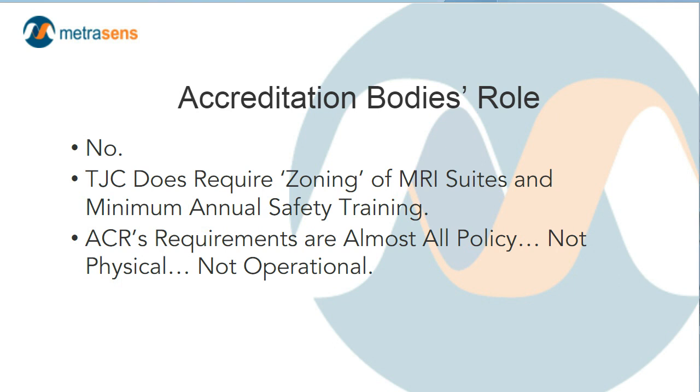But each of those two requirements are really rather ambiguous and anemic, and the Joint Commission has really not made a point of emphasizing these elements in surveys. So while they might appear on paper, the actual implementation of this is pretty weak at this point.